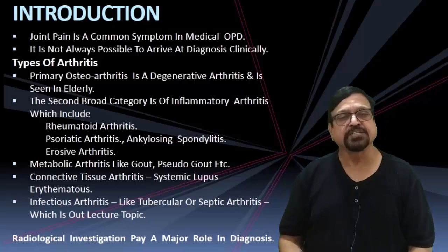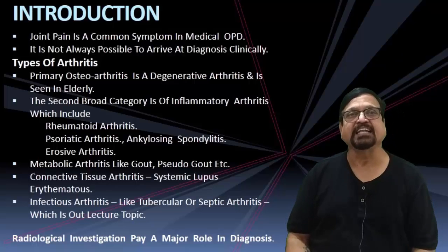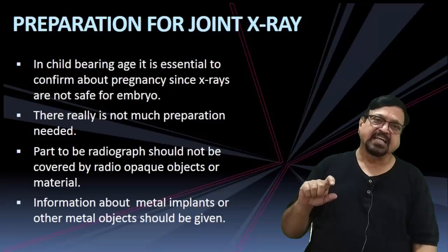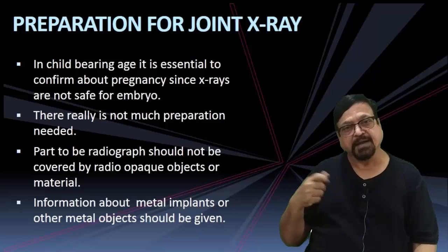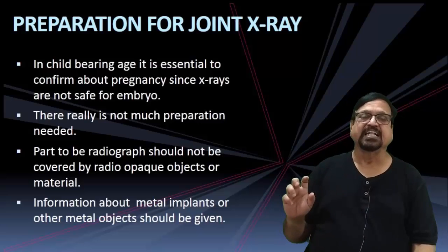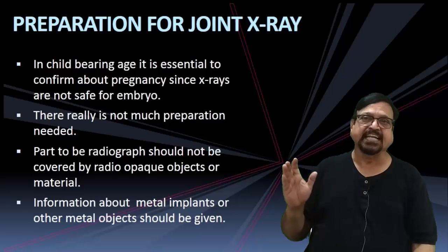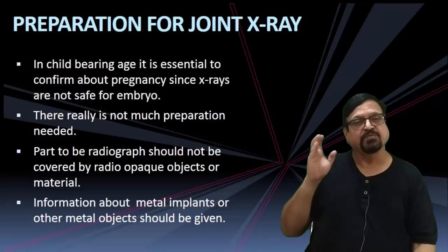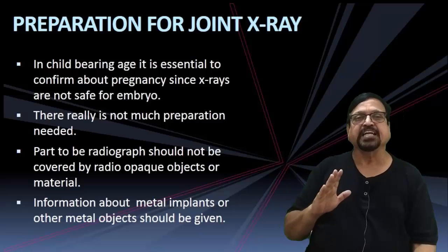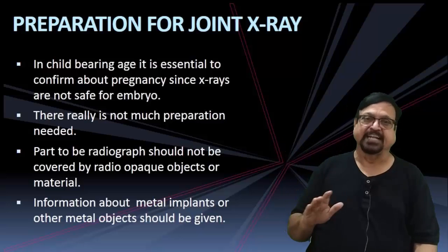Now radiology plays a major role, particularly plain X-ray, because it is a frontline investigation. Now, how do you prepare a patient, and what preparation is required in the department when you go for radiographic examination? Most important, we have to see that radiation is contraindicated in certain conditions. We have to confirm before taking any patient to the radiology room that the patient is not pregnant or not suspected to be pregnant.